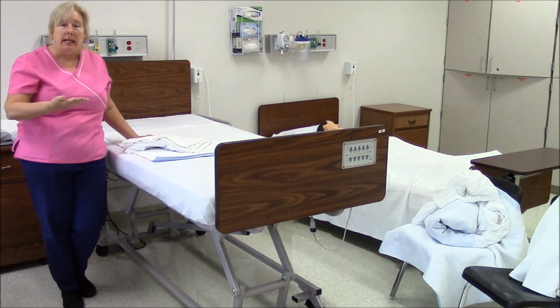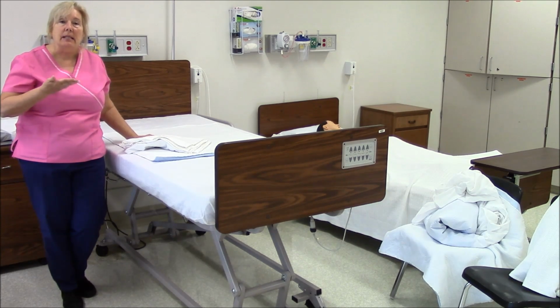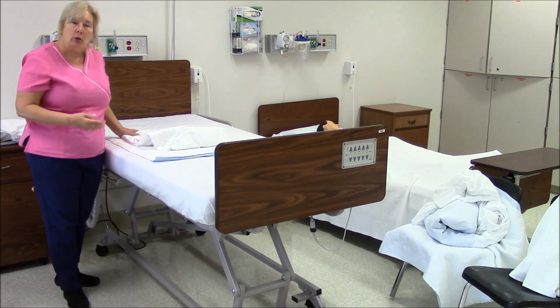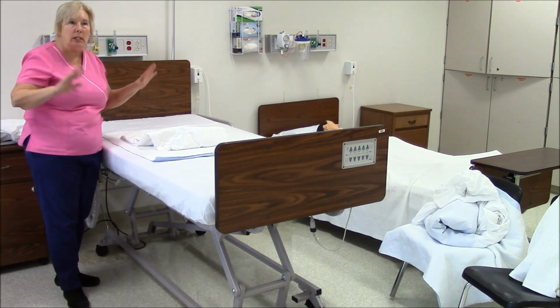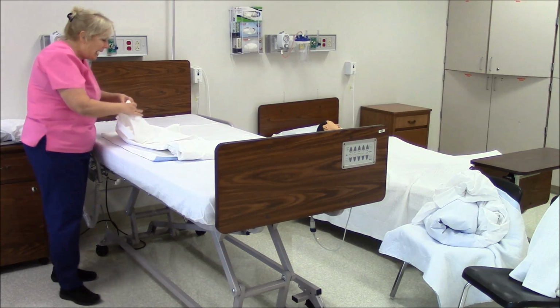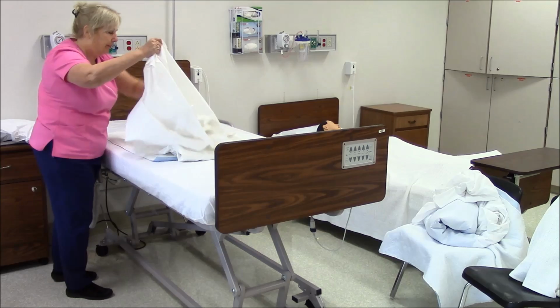And as I make the cuff, you will understand why the seam side for your top sheet needs to be up. And again, like the bottom sheet, you do want to be careful with it and not shake the linen and disrupt the airflow. Here's the top. I feel the seam, and it will be seam side up.